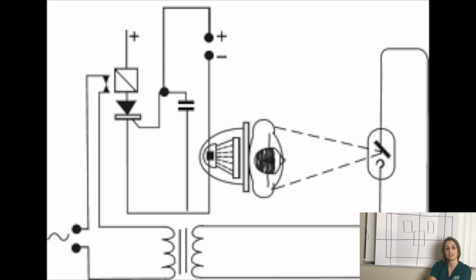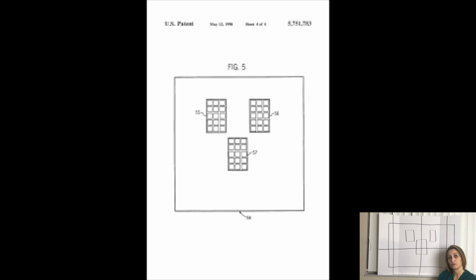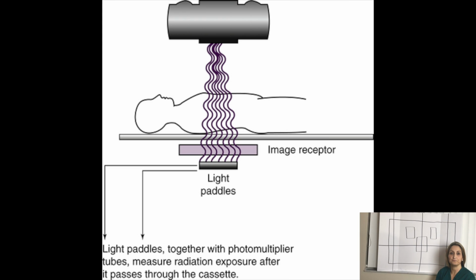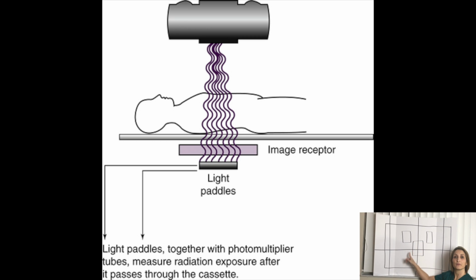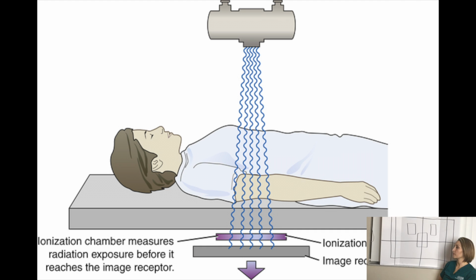There are too many combinations of kVp, mA, SID, exposure time, image receptor sizes, grid ratios, etc. When we have to choose the best combination along with patients that have different body habitus and pathological conditions, the selection of the best combination of factors becomes a really difficult task.